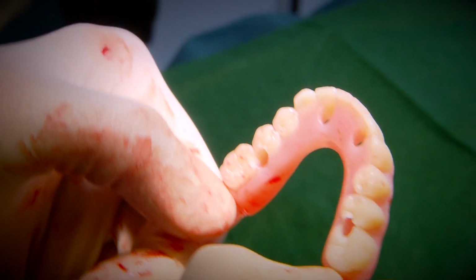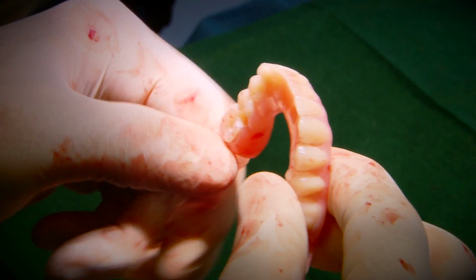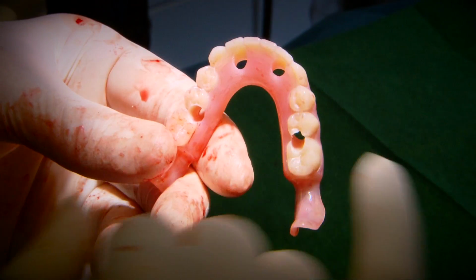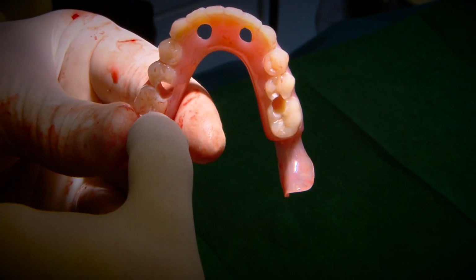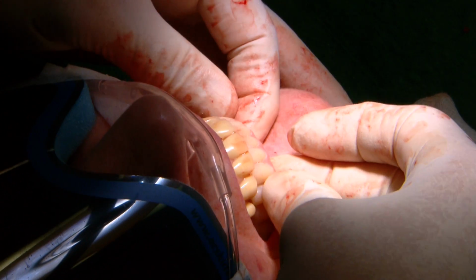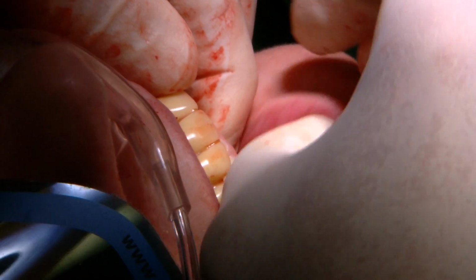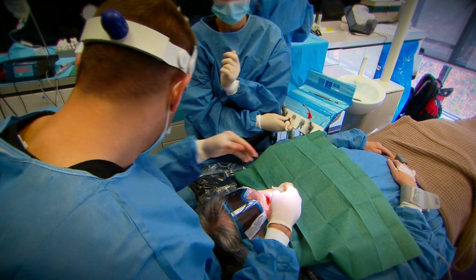So this locates where the teeth should be, locates where the bridge should be, and we know where our implants want to be. We want to basically spread the 4 implants out across the bridge, with the last ones going through, usually depending on how big the jaw is, the top part of the last molar or slightly in front of it. So line up our surgical guide with where the bite has been determined. We can usually feel that. So by doing this, using the holes, we know exactly where to place our implants and what angle to do so.